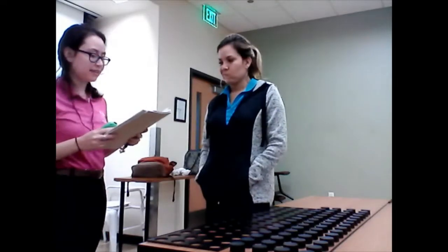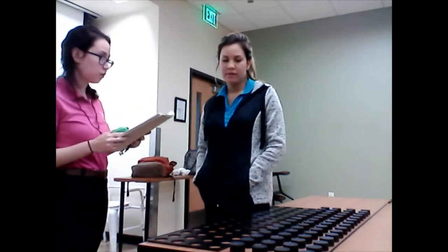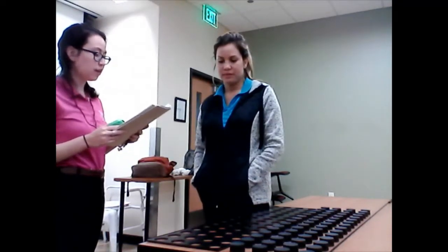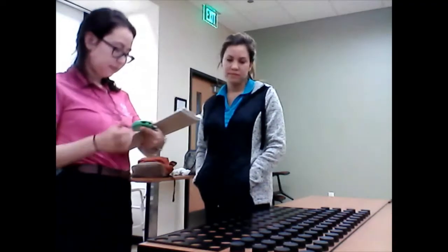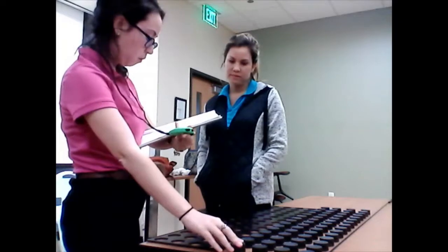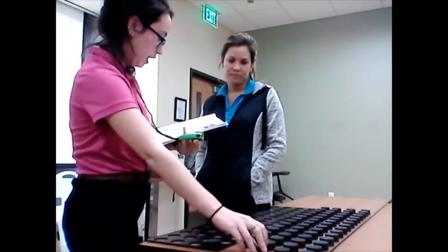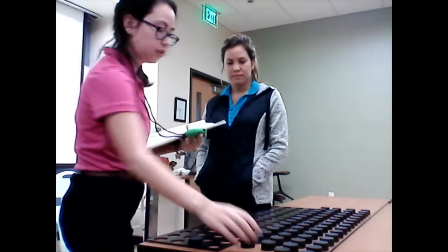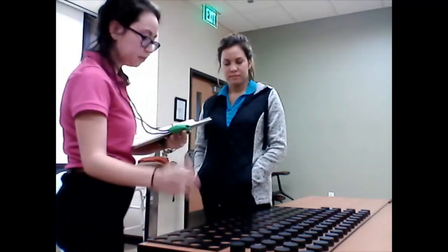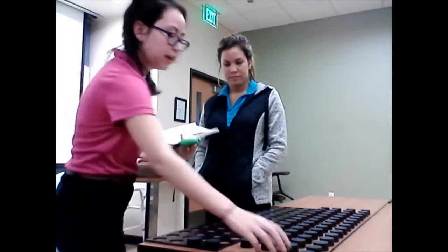The object of this test is to see how fast you can put the blocks back into the holes with one hand. Use whichever hand you prefer. You will begin on your right, and you will put the bottom block into the top hole, the next block into the next hole down, and repeatedly. So as an example, you're going to start with the bottom to the top and work your way down.